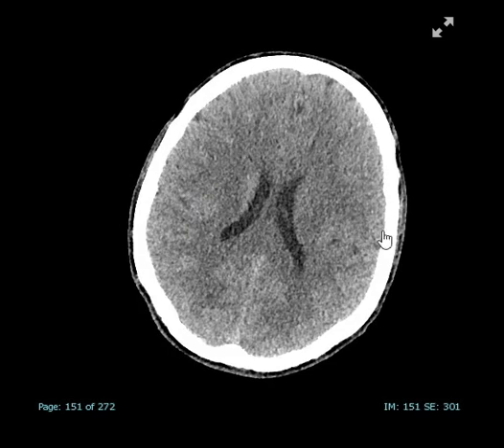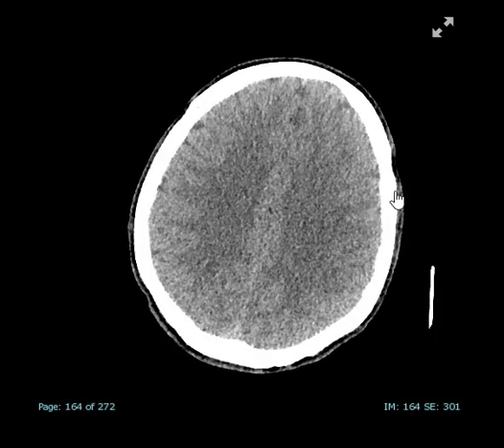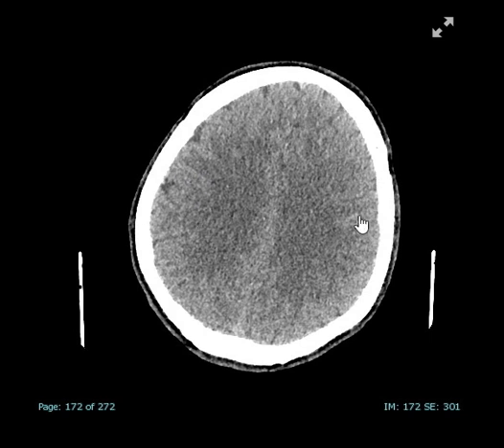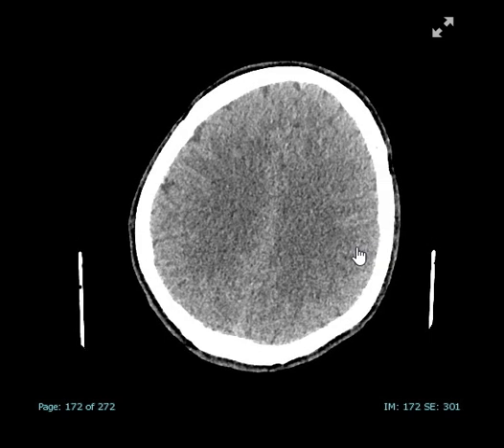On the left, they're very, very smooth and there isn't much CSF space, which would indicate that there's generalized edema on the left side. Look at this — you can see all the sulcation on the right; on the left, it's much less.